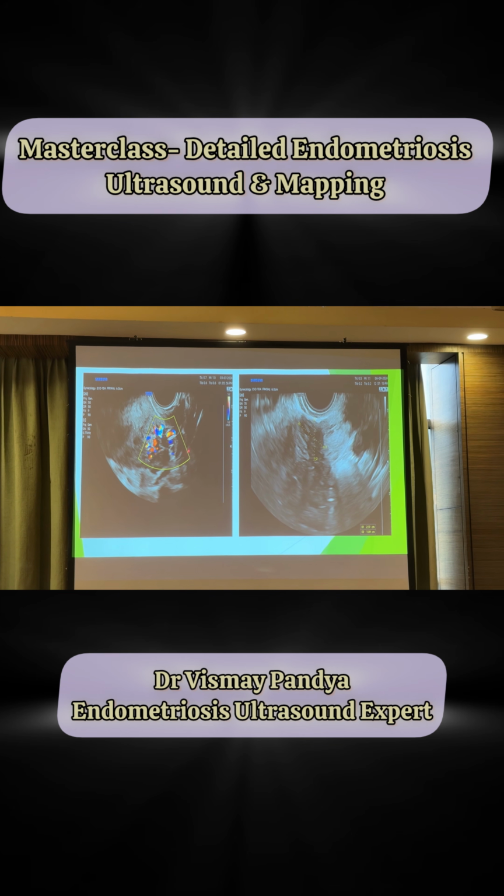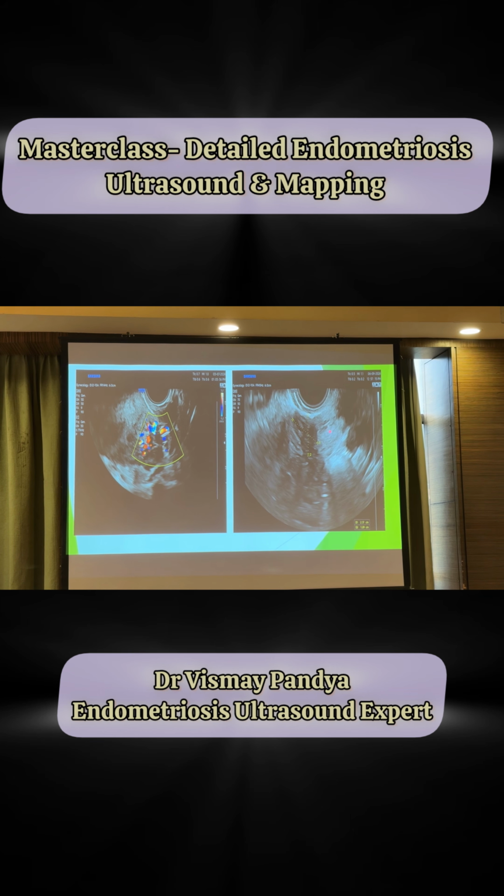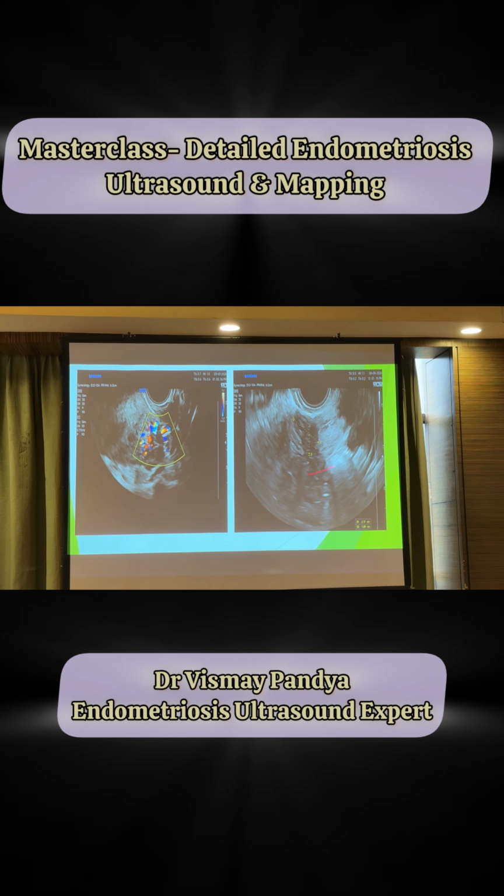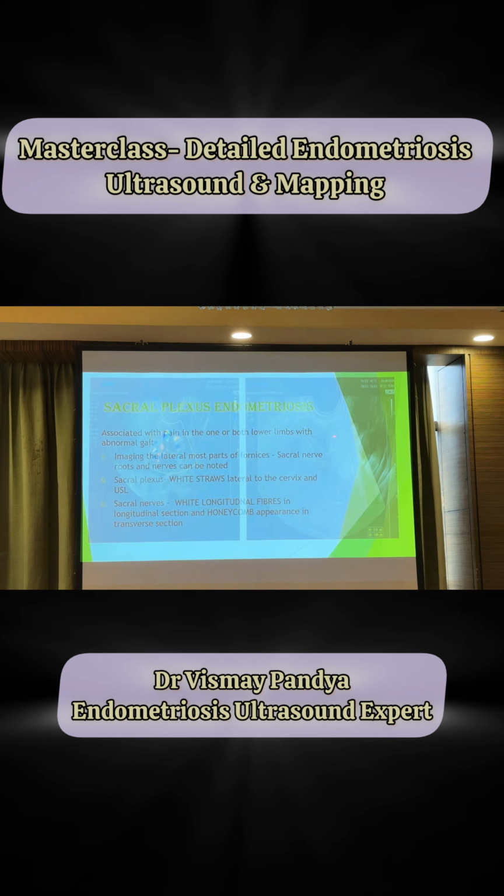and all the vessels here. And this is the nodule here. Now, to pick it up is quite difficult because there is no landmark here. You are just looking at an empty space and trying to find something.